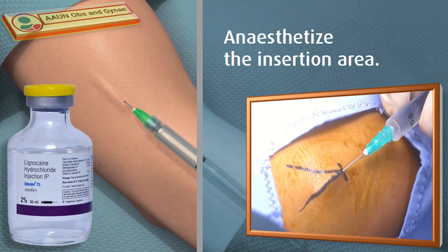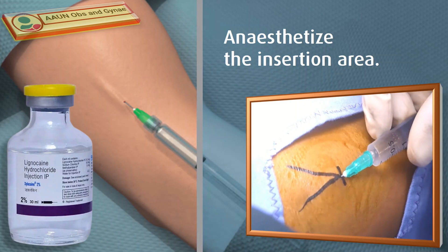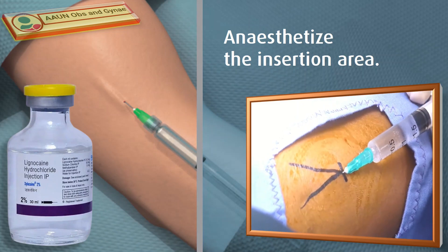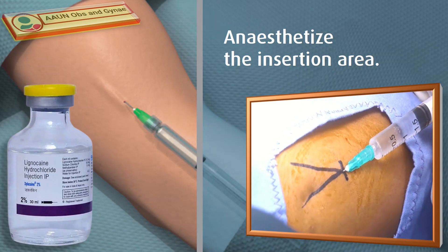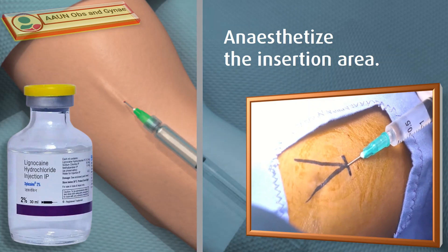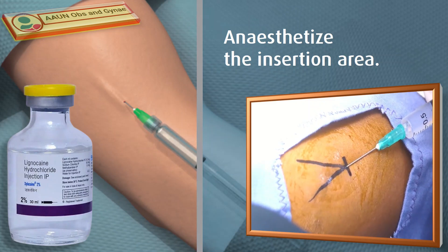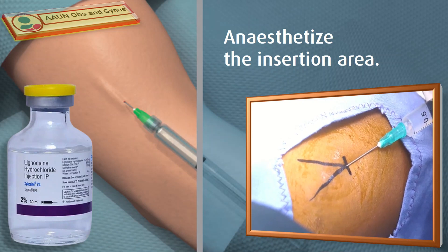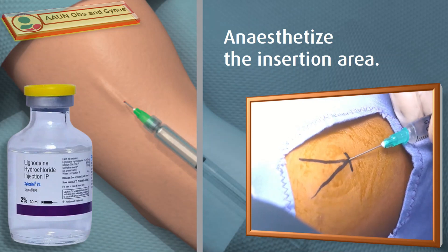Fill the syringe with 2 to 4 ml of local anesthetic. Anesthetize the insertion area by inserting the needle just under the skin, about 5 to 5.5 centimeters in the direction where you are planning to introduce the disposable trocar.